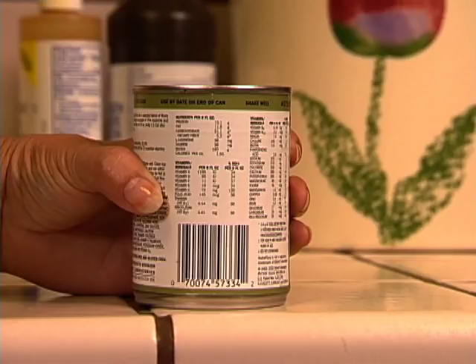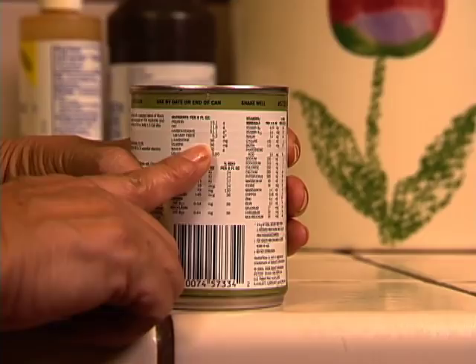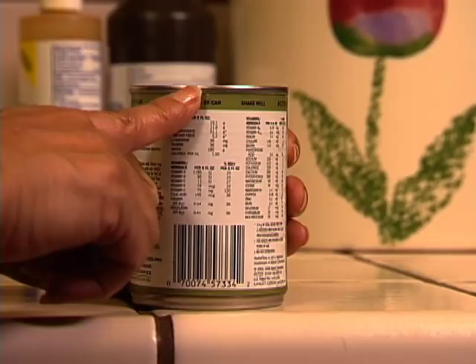When you first begin to use bolus feeding, it is a good idea to start with a half can of formula. If there are no problems, increase to 3/4 and then to a full can. Most people find that it is easier to digest the formula when sitting upright or in a chair during a bolus or syringe feeding session. It is best to remain sitting upright for at least 30 minutes.